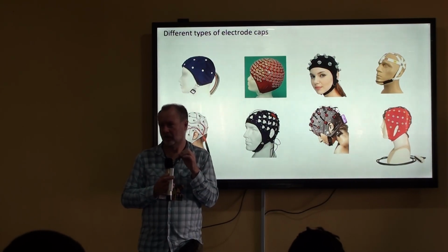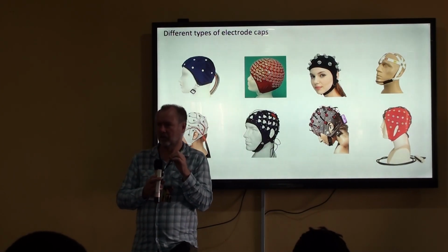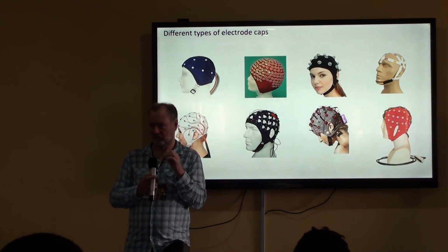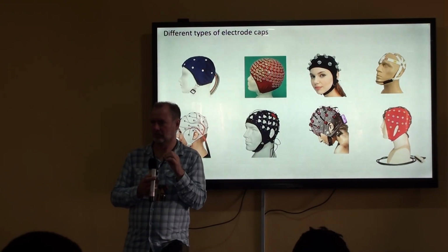So the ground electrode does not necessarily have to be placed in one particular spot.